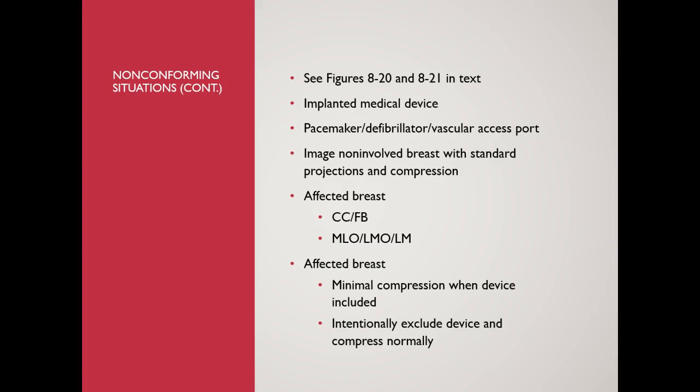A lot of times on the side that has the implanted device, you might want to approach the CC from below. And again, you might want to do the lateral medial approach to come from the lateral aspect of the breast, and then you're not bringing that compression paddle down across that implant.